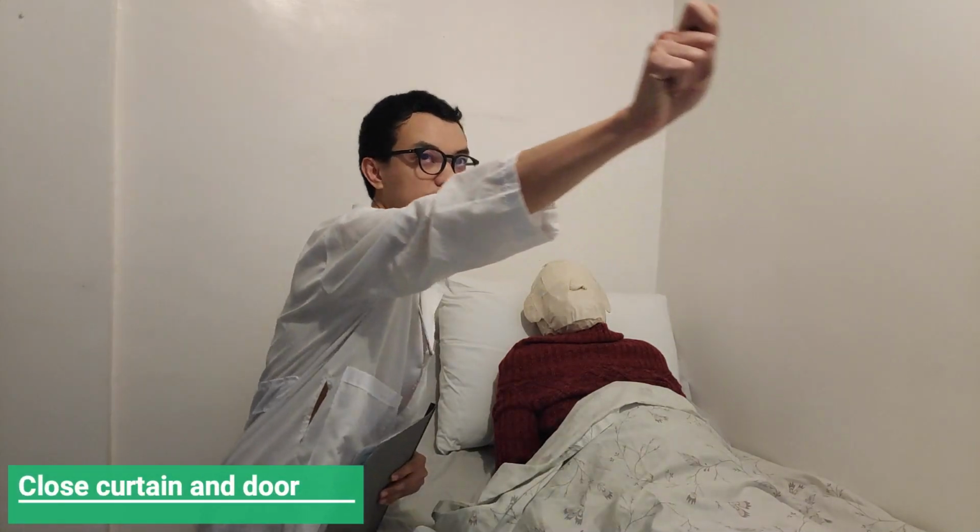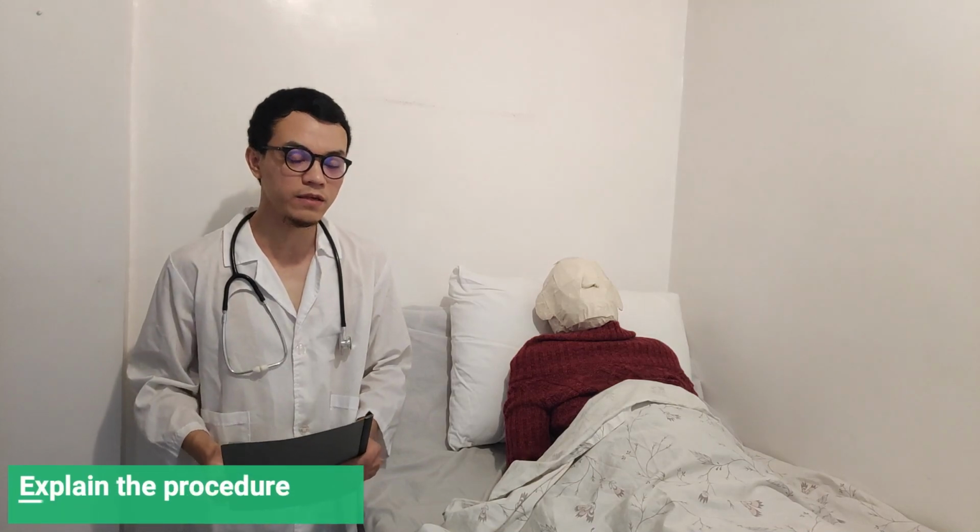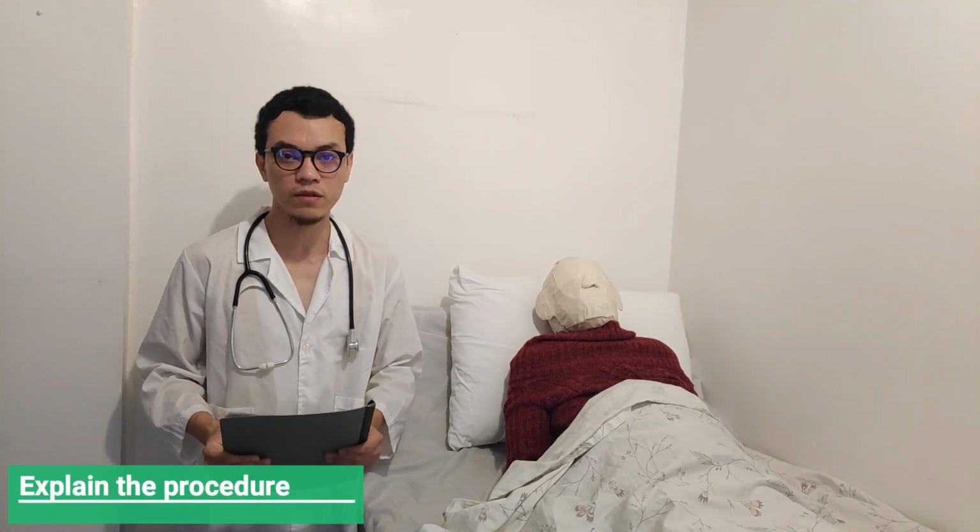After identifying the patient, you can now close the curtain around the bed and close the door to the room to ensure patient's privacy. Next step is to explain the procedure and the reason for doing it to the patient and review safety precautionary measures when the oxygen is in use. Don't forget to place a non-smoking sign in the area as needed. Explanation will lessen the anxiety or discomfort of the patient towards the procedure, and placing a non-smoking sign will prevent any kind of possible accident.